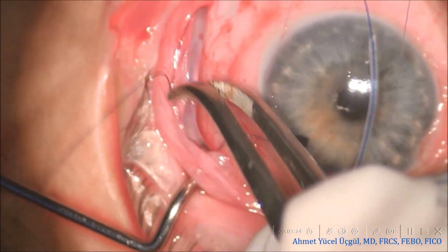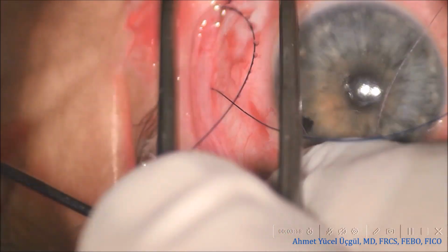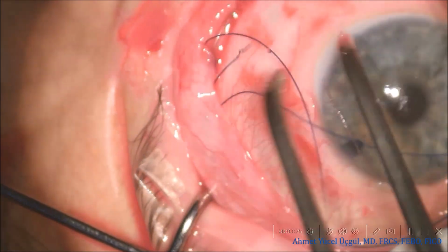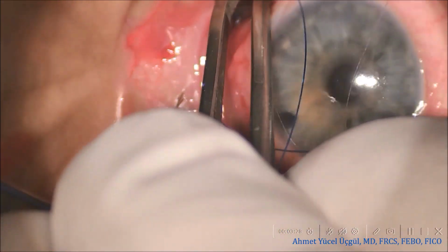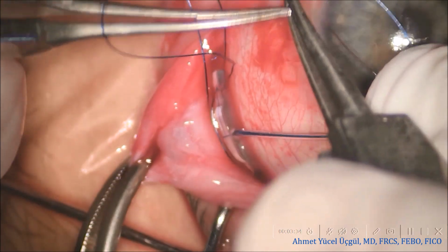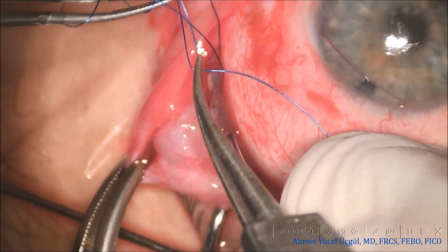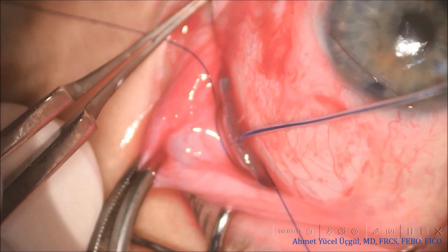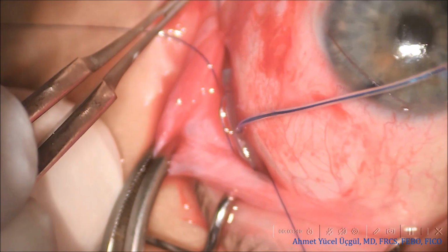If the plate is simply pushed directly into the prepared pocket without proper placement beneath the rectus muscles, the risk of postoperative implant extrusion or explantation increases significantly. I tie the horizontal mattress fixation suture in a way that leaves the knot buried beneath the plate. I prefer this configuration because it helps reduce the risk of postoperative suture erosion.